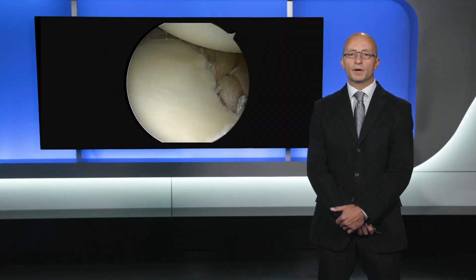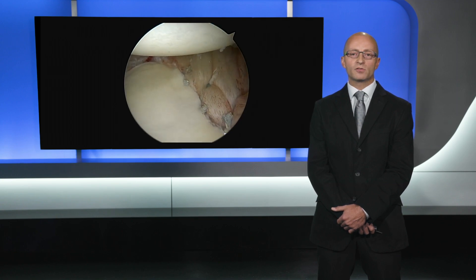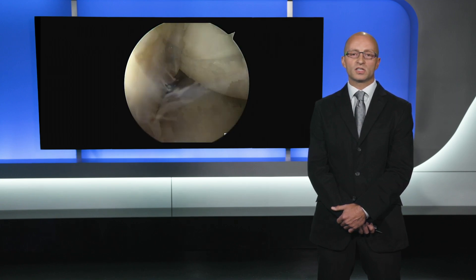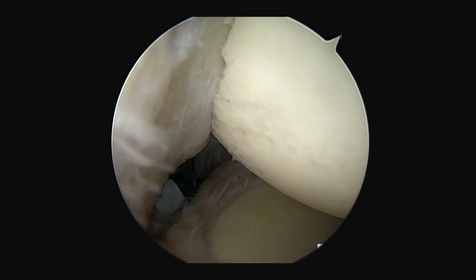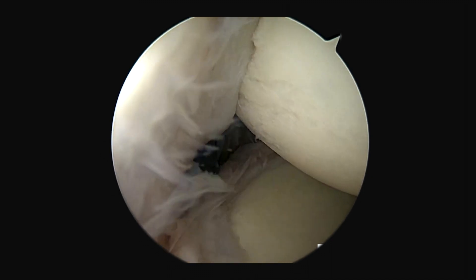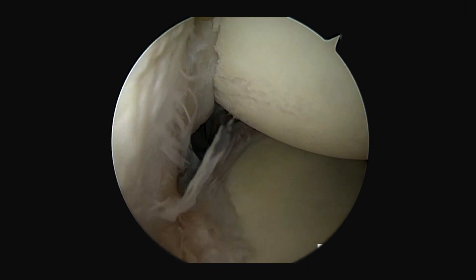Here's our completed Bankart repair, and now I simply need to complete the remplissage. Since I have those sutures coming out the percutaneous cannula posteriorly, I can link those two anchors through that same cannula to create my double mattress knotless stitch without having to go into the subacromial space. There you see that posterior capsule nicely inset into the humerus.